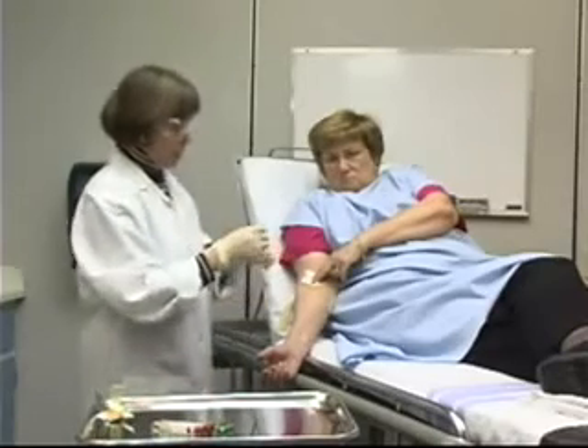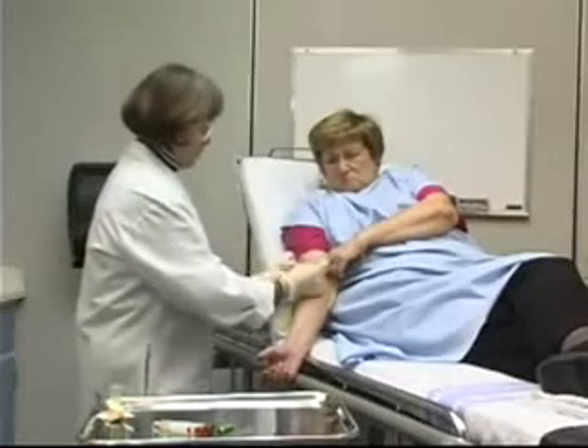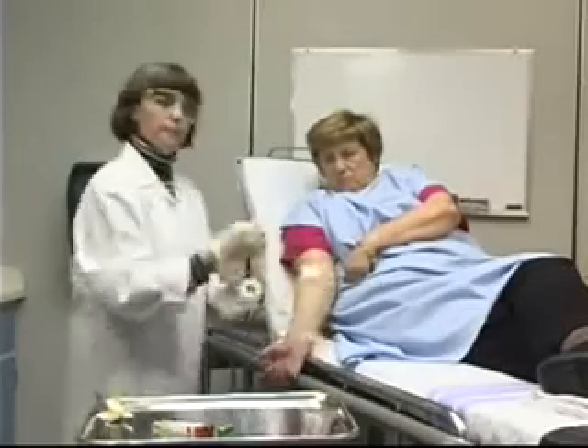The last step is to come back to my patient, and we'll just put a piece of tape over the gauze. And we're done.